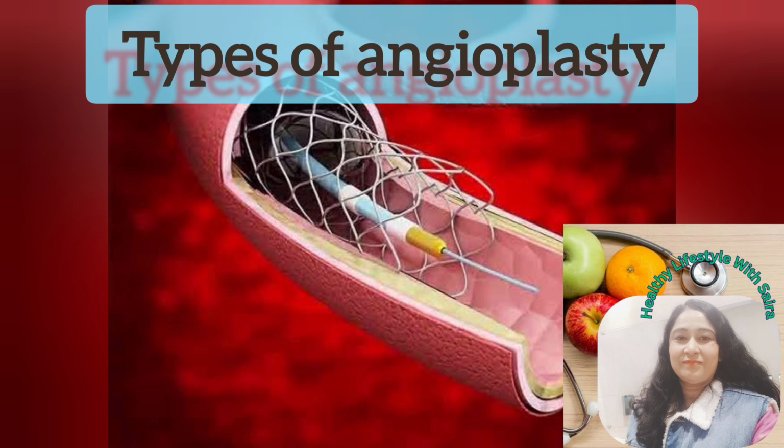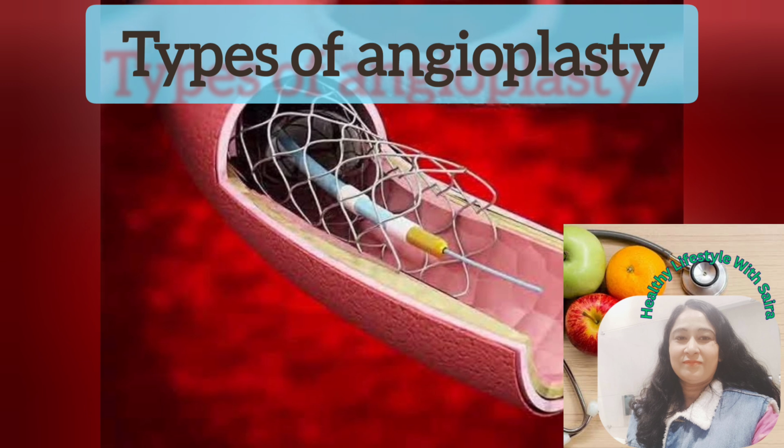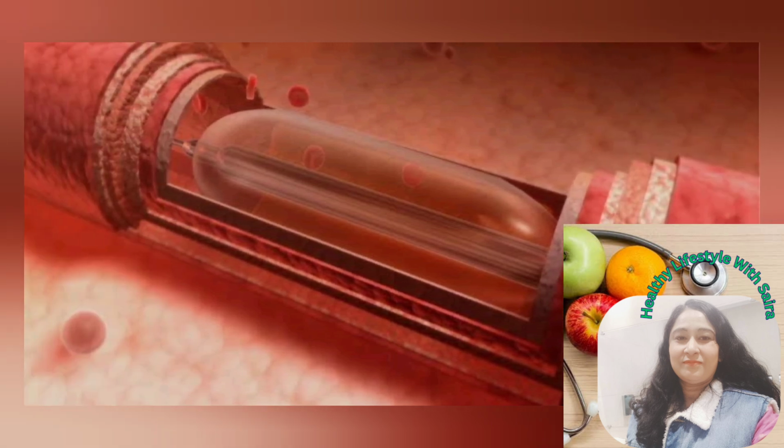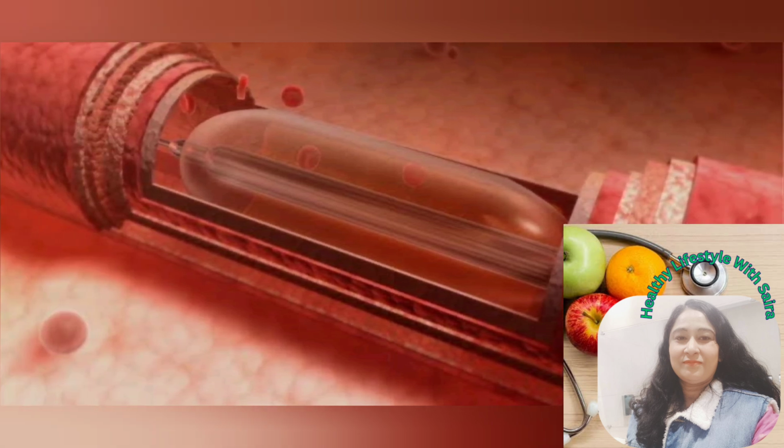A percutaneous coronary intervention involves using a small balloon to open or unblock the affected artery. A doctor then places a small mesh metal tube known as a stent into the artery to keep the blood flowing. A balloon angioplasty also involves using a small balloon to open the artery.